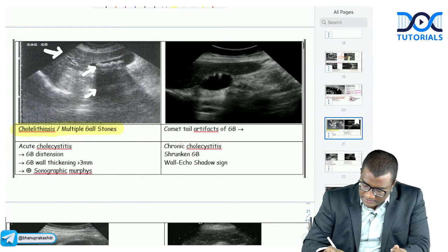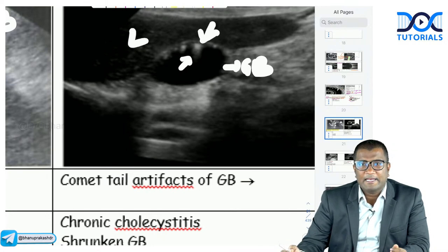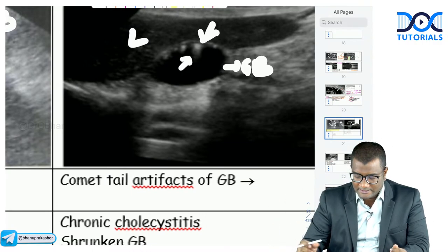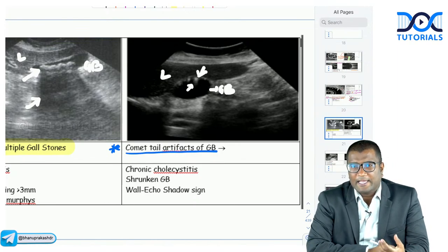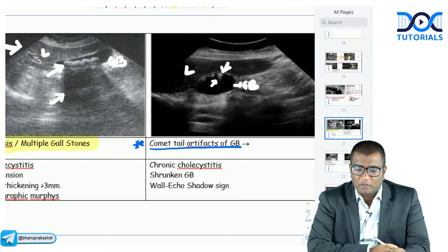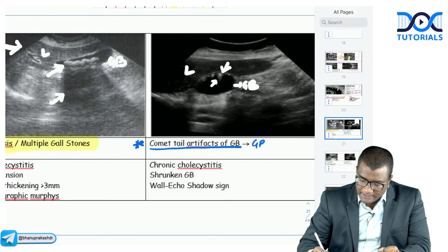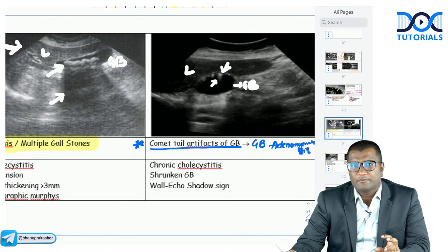In another image, the gallbladder shows hyperechoic areas but instead of posterior acoustic shadowing, you see comet-tail artifacts — falling-star or comet-tail-like areas rather than a black shadow. When you see comet-tail artifacts in the gallbladder, this is gallbladder adenomyomatosis. Remember: gallbladder adenomyomatosis shows comet-tail artifact, not acoustic shadowing.